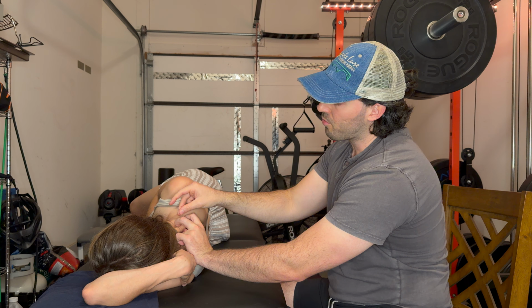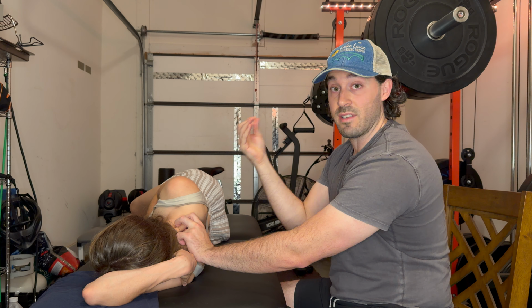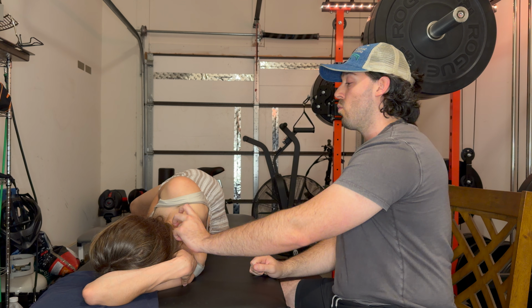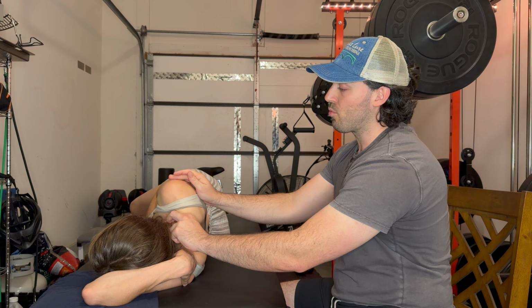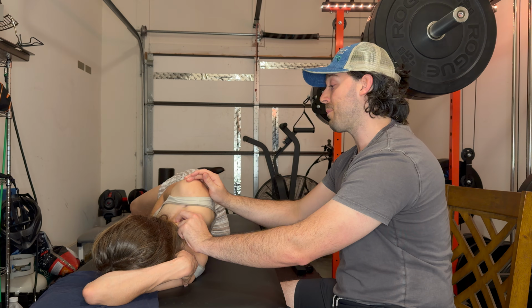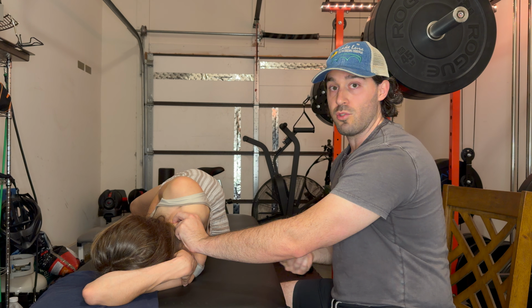My needle direction will go straight in here towards my thumb. So I'm needling towards the thumb as a safety backdrop. Again, kind of peppering through this direction. We can even work up and down different portions of the levator scapula here too, so the same rules apply. I can have my patient superiorly elevate and then depress the scapula, and I'm on a different portion of the levator scapula here. This is a really good way to do it from the sideline position.